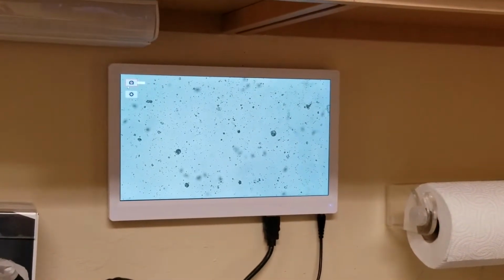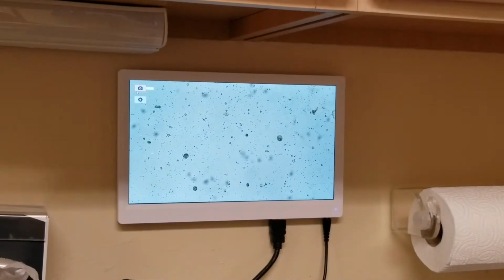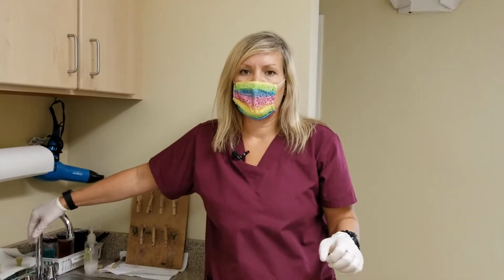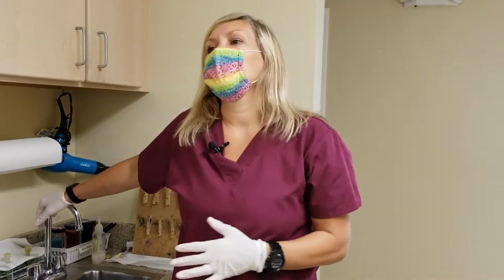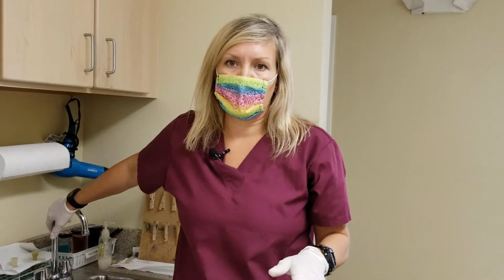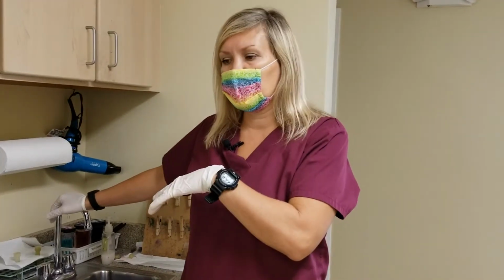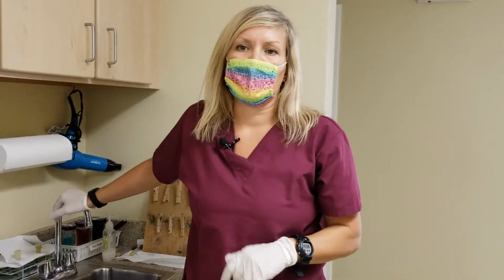Hey Missy, how long did it take for you to get comfortable reading fecals? Well, it takes a while. It probably took me a month or two here to get to know exactly what the parasites commonly are with the animals. In dog and cat, they're pretty similar, but dogs and cats are less likely to have parasites because they're people's pets, which usually have been treated. So it's less frequent that you see it. But getting to see pretty much every wild animal has parasites, you get really good at doing fecals.